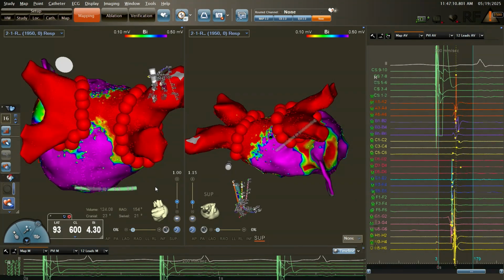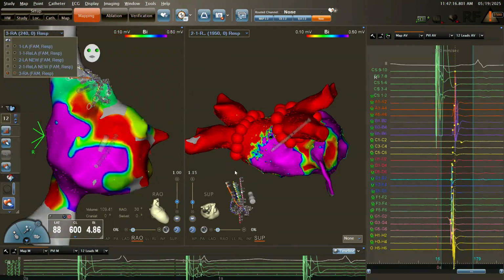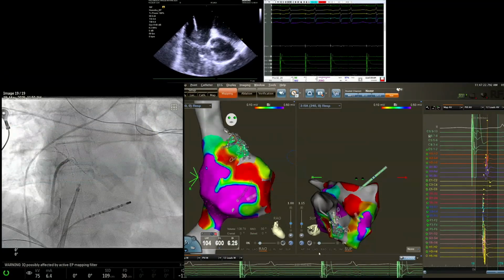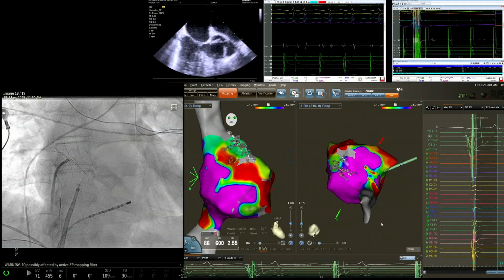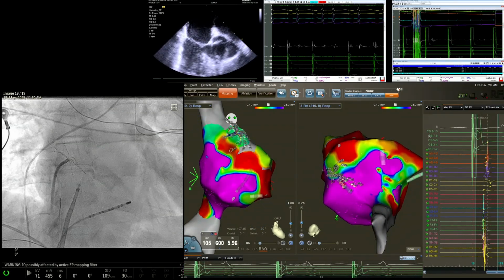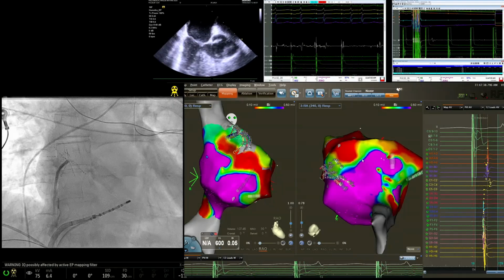For now, let's go to the right side. I want to do a CT isthmus line. Can they see everything? Can you show the fluoro also on the ICE, so they can see everything? We also have nitrates here. Okay, let's put over here. You guys see the ICE image too, right? We can see it all. It's good. Yeah, it's still moving around. It's not twerking quite as much as it was before, but I still don't really understand what's going on with this.